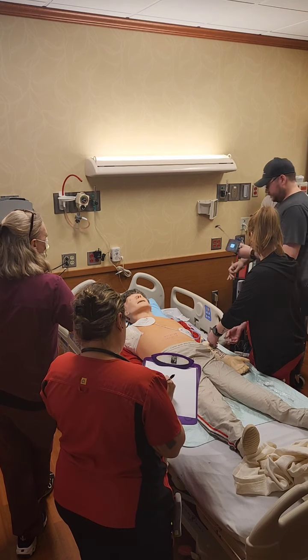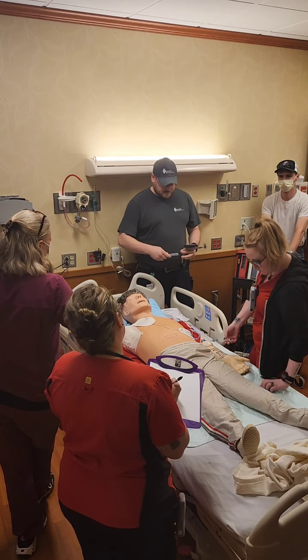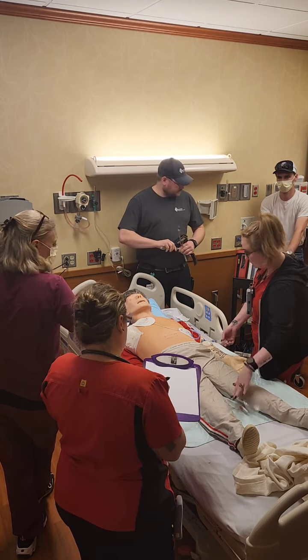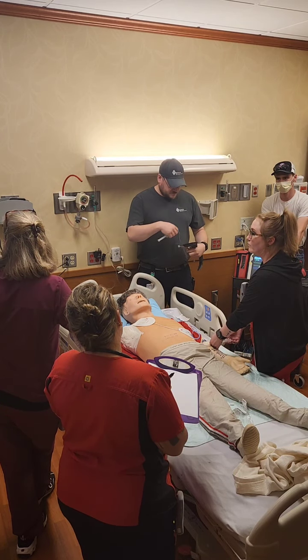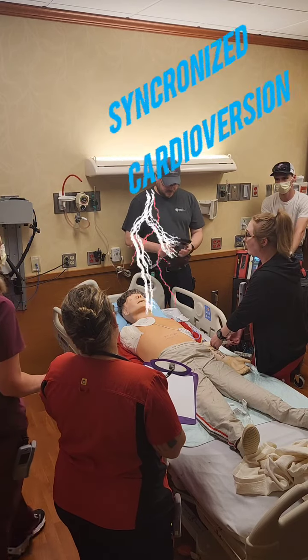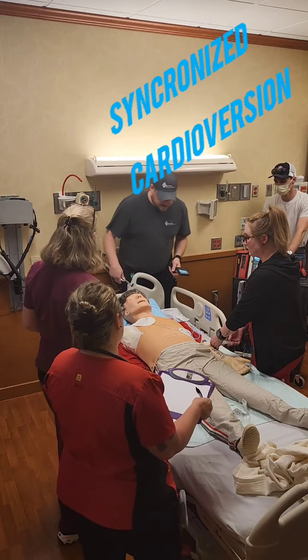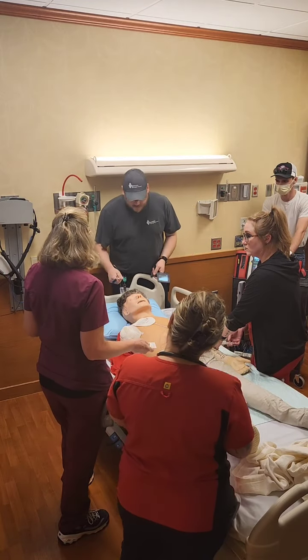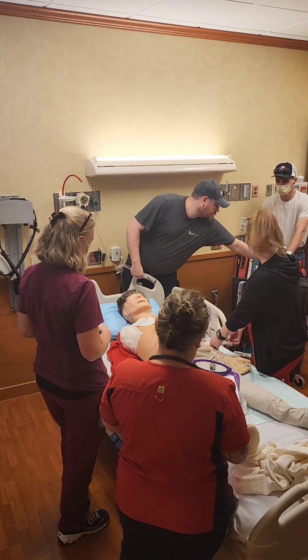Okay, was it the amio? I mean, I think he's going this direction regardless. But what else would we do for an unstable pulse, or VTach with a pulse, non-medication wise? Cardioversion. Yep, and he's unresponsive so we don't have to sedate him, but he's also symptomatic, so let's cardiovert.